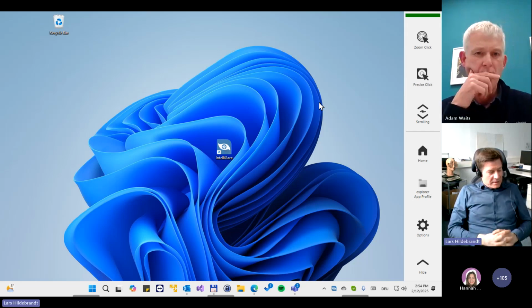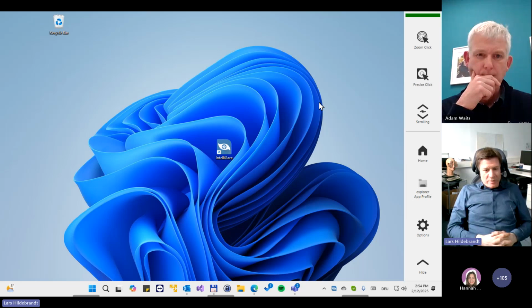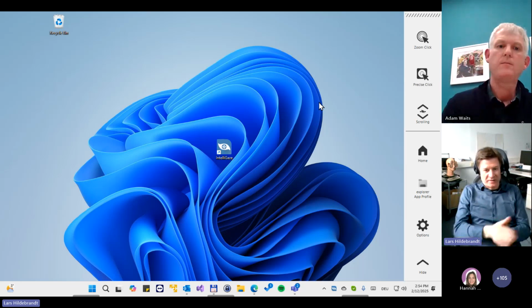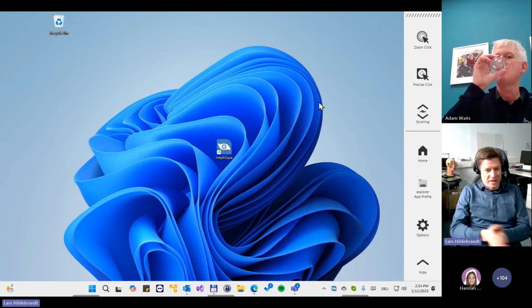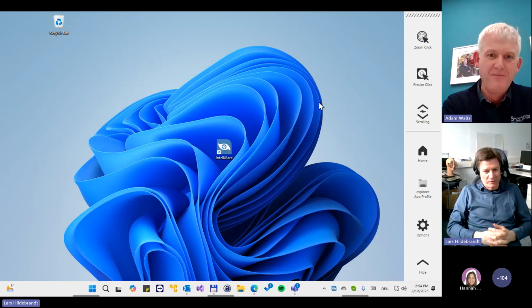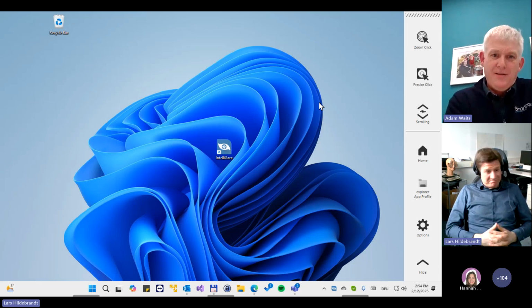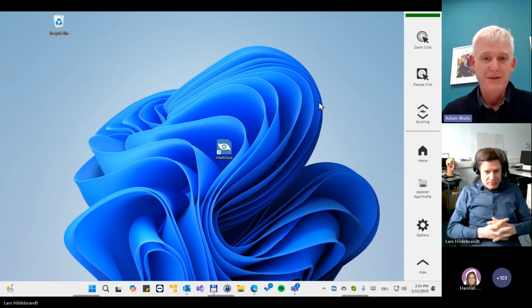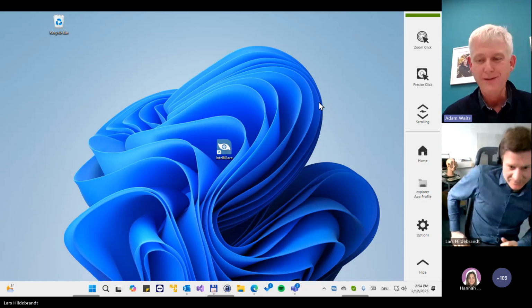Yeah, I can. Ability Drive is a so-called API application as well. That means it's using the same data channel to IntelliGaze as Grid, so therefore they can't run at the same time. They have to be run and operated exclusively. Brilliant. So right now, no. The answer is, however, no. Sometimes no is quick and concise.